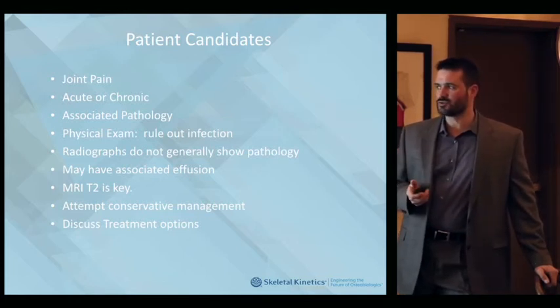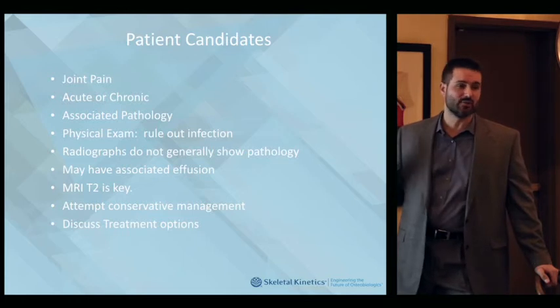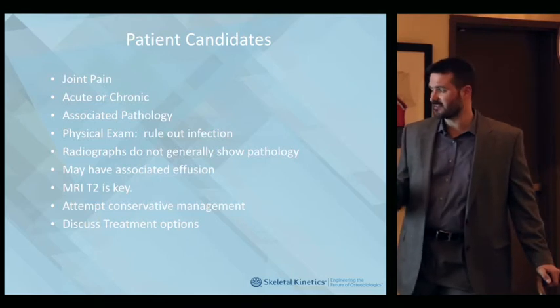X-rays don't generally show the pathology of the problem. So an MRI is key. I always try conservative management at first, or at least offer it, but most patients, I will tell you, want to do this. If you tell them this versus 6 weeks of non-weight bearing, they're going to choose this right off, and it's easy. It's not difficult, and it works.